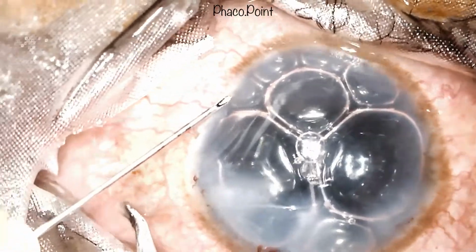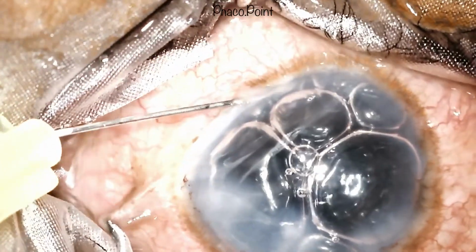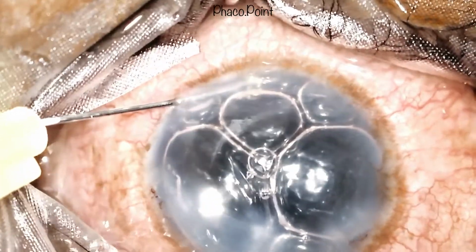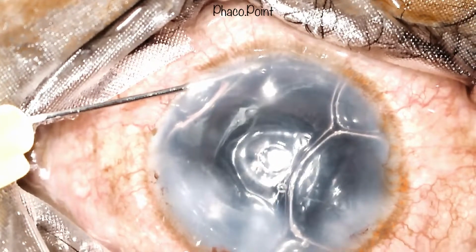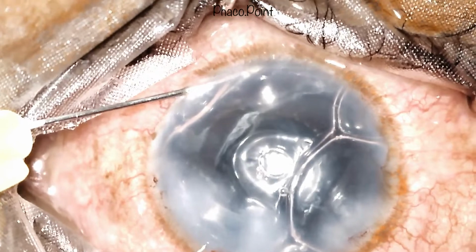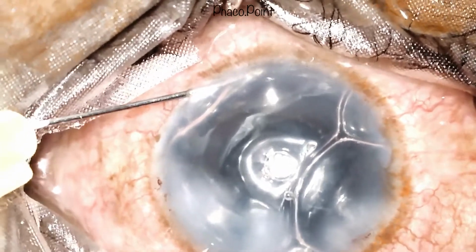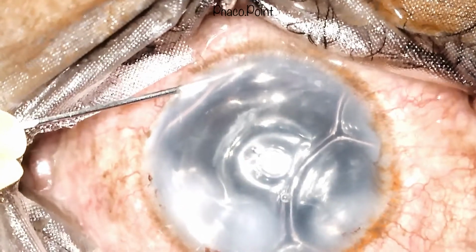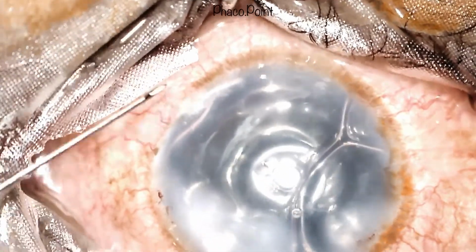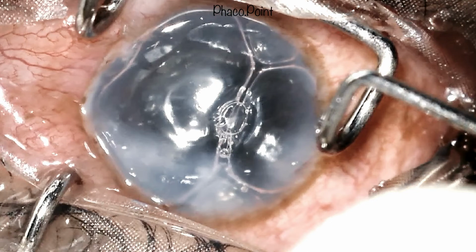This descemetopexy is further augmented by introduction of some more air with the help of a 30-gauge cannula connected to an air-filled syringe to tighten the air fill in the anterior chamber. A few minutes later, this is the kind of corneal clearing that we did see. This brought us to the end of the surgery.